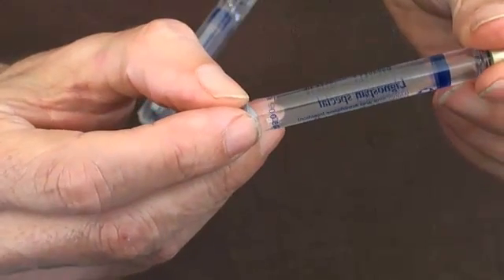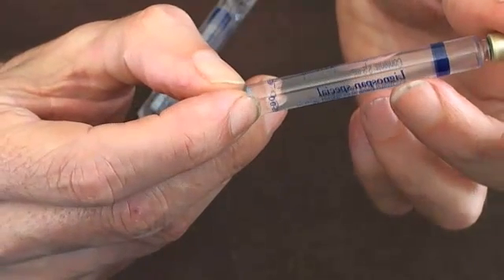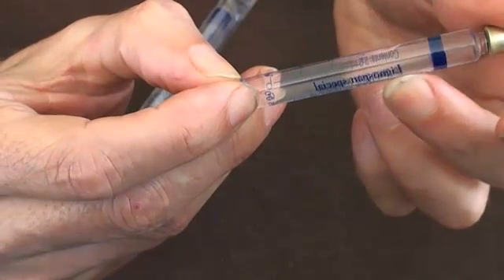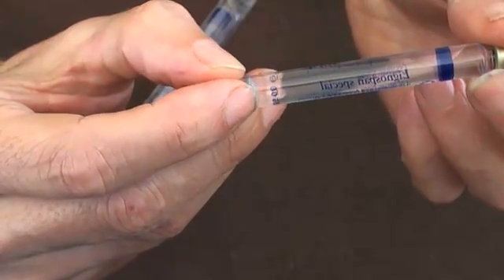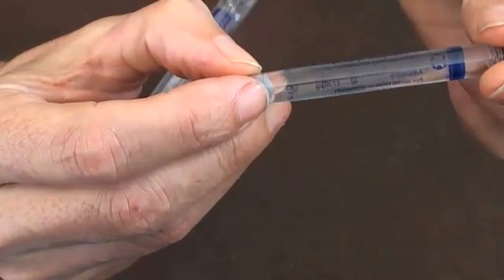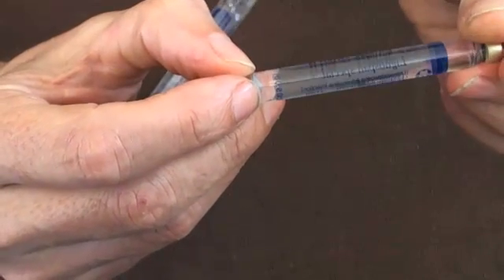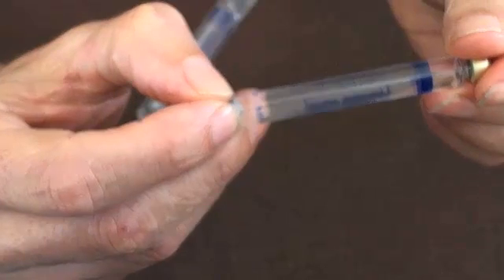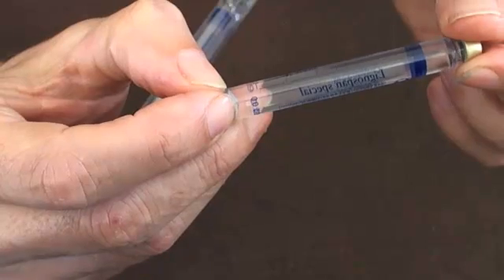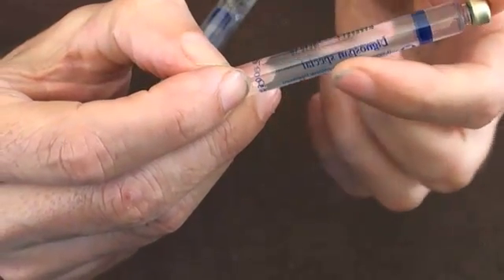When you look at the writing itself, this carpule contains — this is the name of the type of local anaesthetic that's in it. This is called Lignocaine Special, by a company called Astra. The writing is in blue. Be careful — one of the traps with local anaesthetic is that if you rely upon the colours, you can get caught out with different brands containing different drugs. So this is Lignocaine Special — make sure you read it.